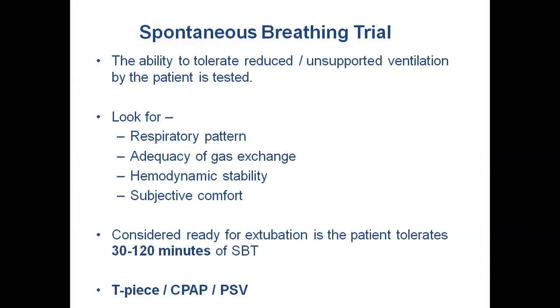So it can be T-piece. On T-piece, what is the support you're going to give? What is the support the child is going to get on T-piece? Oxygen, sir. Pressures. I'm talking about pressures. Can the child get any pressure support on T-piece? Zero. The pressure support the child is going to get on T-piece is zero. It will get only oxygen.